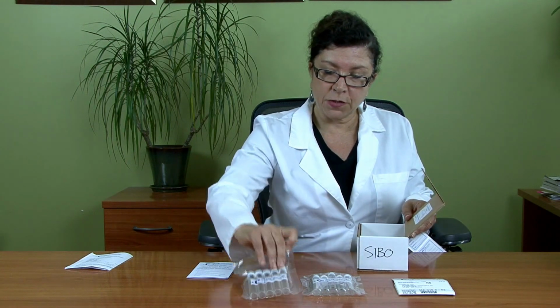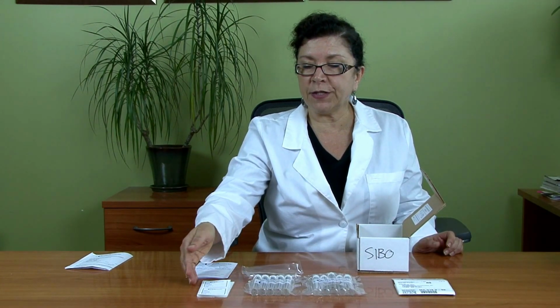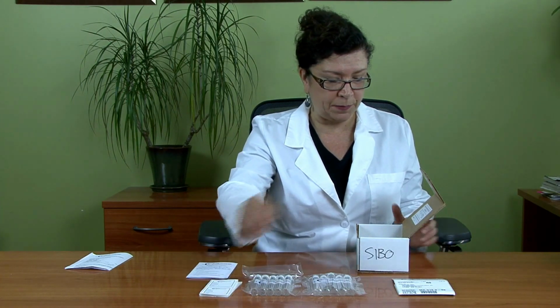And then of course the test collection tubes, and I'm going to bring these out. There should be 10 of them in the SIBO test. So there are 10 test tubes. There are labels for each one of the tubes. Now the labels require you to put the date, of course your name, the doctor's name or the provider's name, and of course there's 10 samples, so you're going to have sample 1 through 10. So you need to label them properly. You'll see the sample number and then the time that you actually collected the sample.